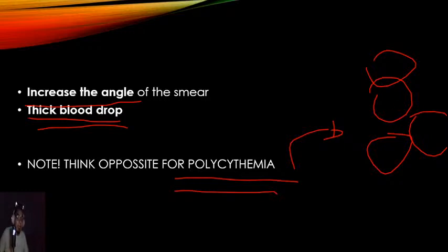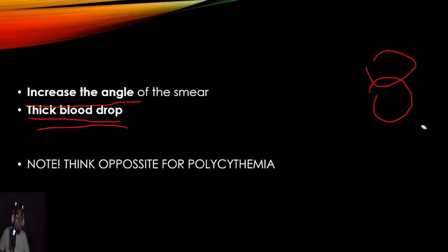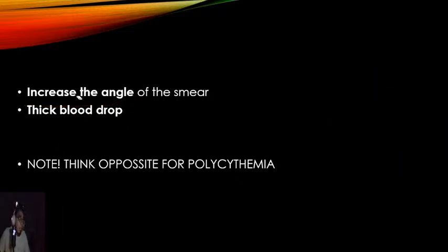That's one of the things you need to take into consideration when making a smear. Theoretically pa rin siya.